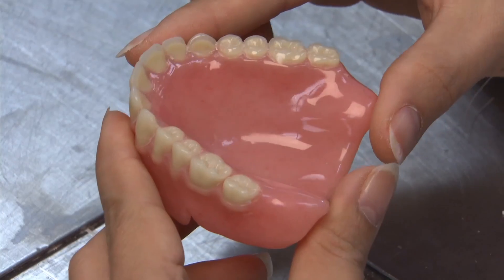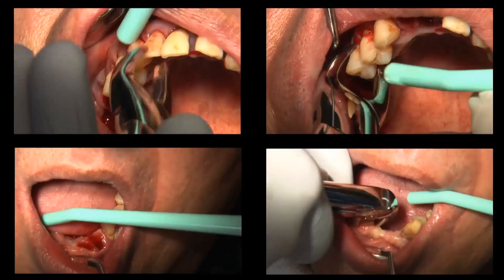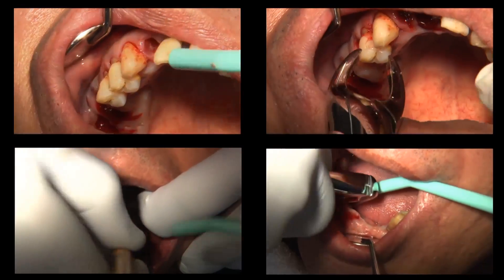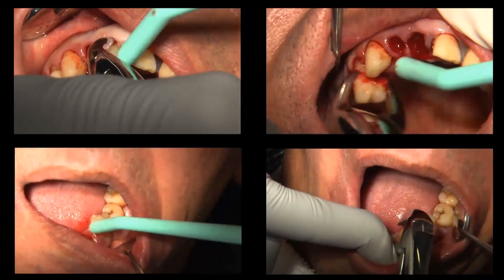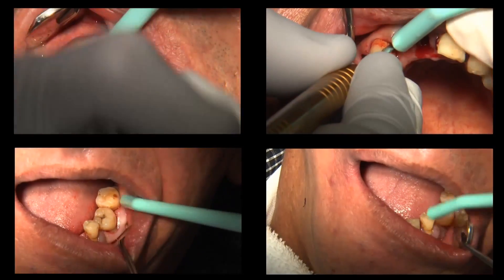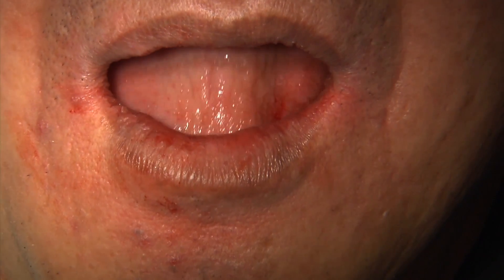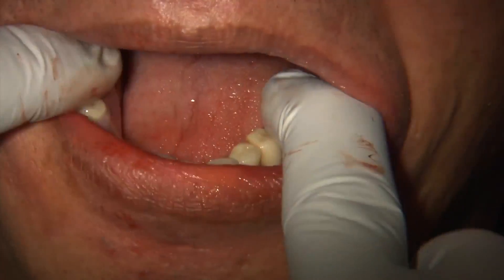Here we have a nice final product. The denture is ready and the technician wraps it up and sends it back for the actual procedure. When the patient returns for the second appointment, the extractions are fairly easy, relatively speaking, especially because of the patient's periodontal condition. The teeth are gently extracted and all the sockets are curetted and cleaned. Because most of these teeth were retained with the tissue, the healing time was fairly quick. The extractions are completed and the denture is relined with Kosoft reline material and delivered at the second appointment.